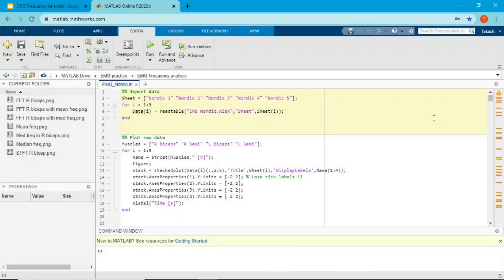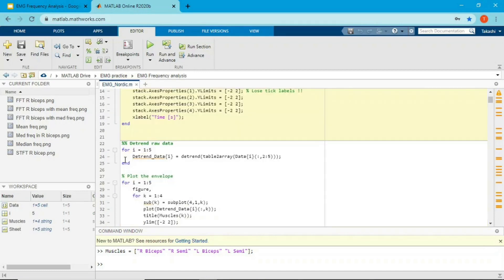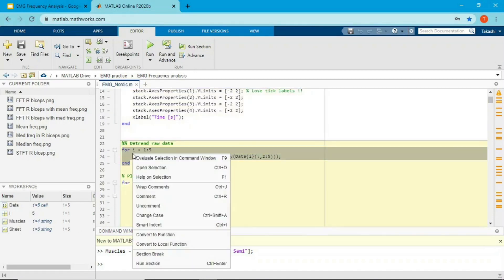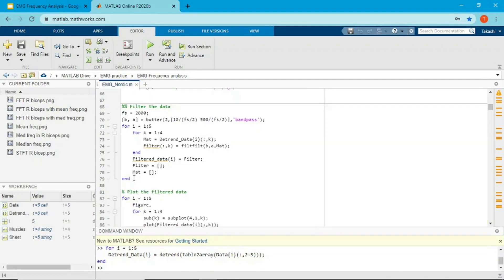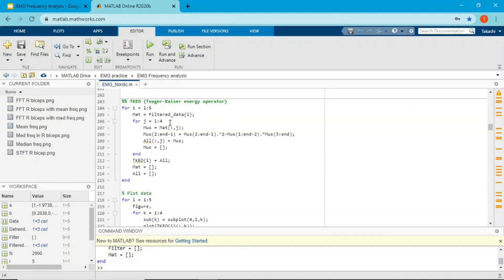In MATLAB, first I'll import the raw data — check my previous videos for details on the raw data. I'll run the muscle names line, then detrend the raw data, then filter it with a band-pass filter with cutoff frequencies of 10 and 500 Hz.